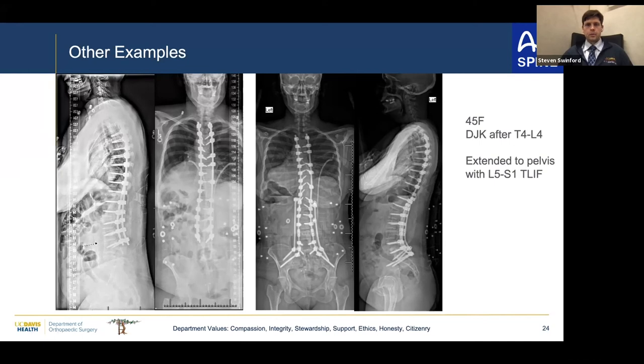Last thing I would mention is we see a fair amount of trauma here at UC Davis, and I should have put this one in here, but there was a thoracic dislocation where we were able to use a similar concept with the side-to-side rod distraction technique to help reduce that. And it's extremely powerful and a tool I plan to keep in my back pocket.